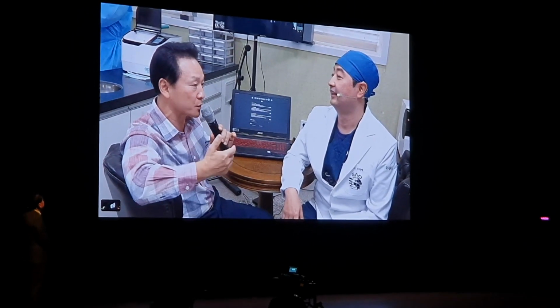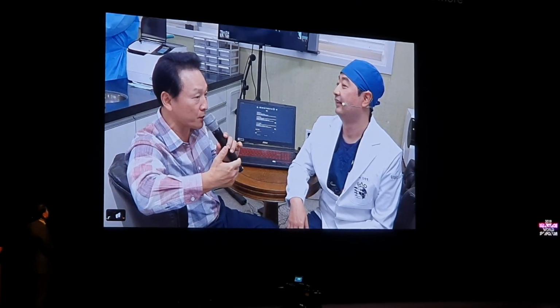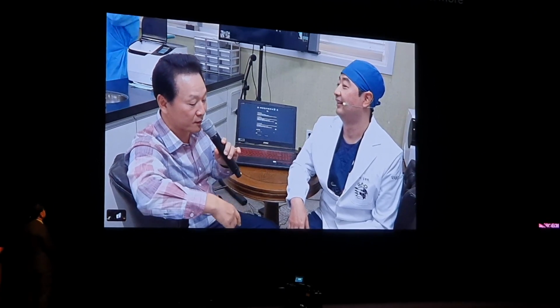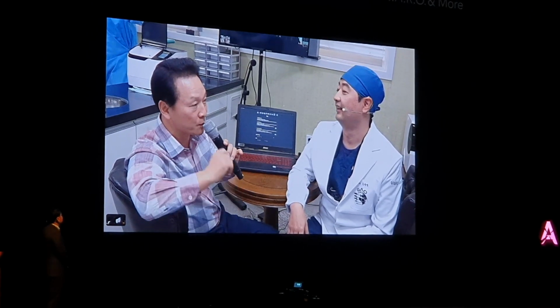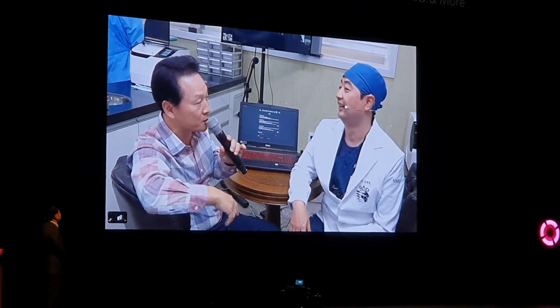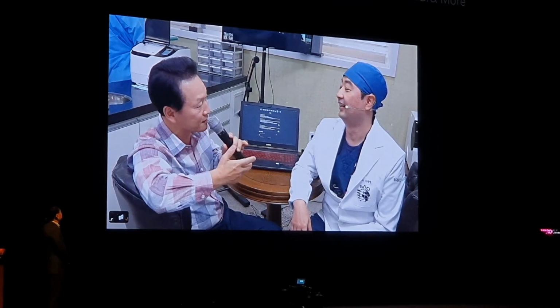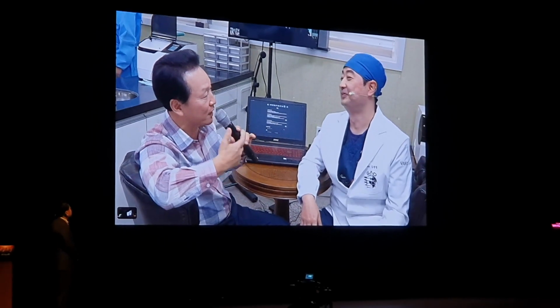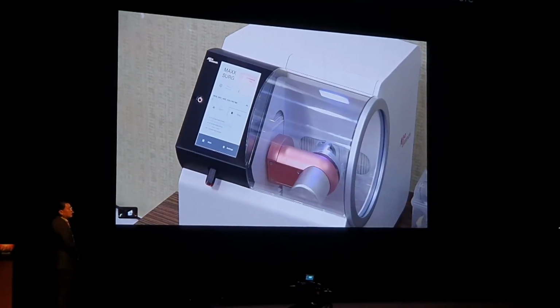I gave a lecture this morning that the guide is so accurate, and if I myself can't trust the guide, then what else can I say? So by depending on the guide, I only need to do the drilling, and if anything happens, I have Dr. Kim next to me, right? So Dr. Kim can finish the work, and if anything goes wrong, he's got my back.